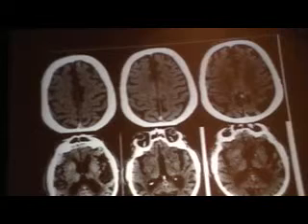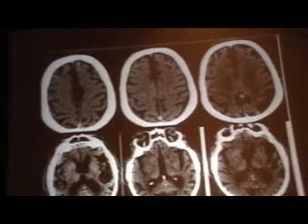This is a 75-year-old man who fell off his stool. I didn't tell you which side was his deficits because I wanted you to look at the CT scan and tell me if you see any early ischemic changes. Okay, so no obvious early ischemic changes. This is at 3 hours 25 from onset. I wasn't comfortable using that alone, so I went to diffusion-weighted imaging. There's a whole territory infarct. This is a FLAIR, so based on this MRI, I decided not to go any further.